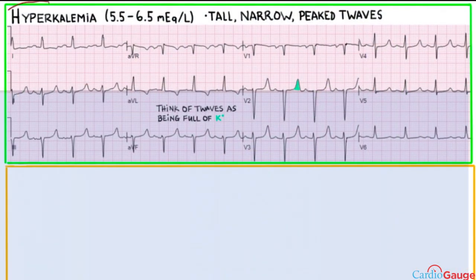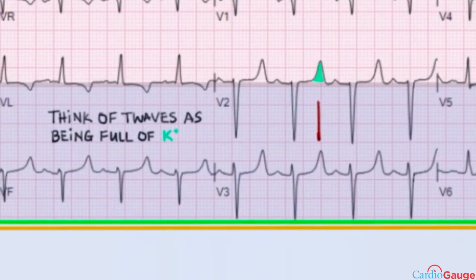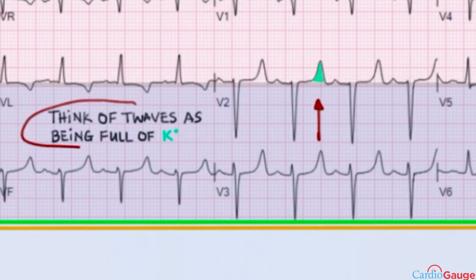Okay, let's go over mild hyperkalemia. For potassium approximately 5.5 to 6.5 milliequivalents per liter, the main feature is tall, narrow peaked T waves. You can think of the T waves as being full of potassium.